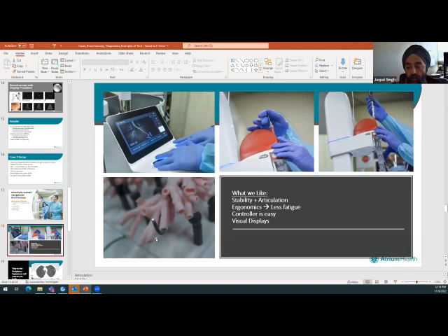Well, I'll say a couple of things. What we like about it is it's very stable. So I can make a turn, and now I don't need a catheter to guide me. I can just park my turn there. It holds the spot, and I can biopsy all I want. So if a patient has a really tough lesion to get to, I can aim really precisely and control it. My hands are free.